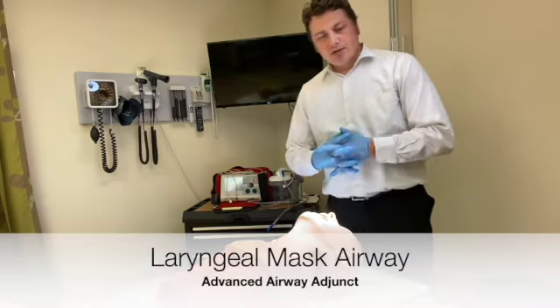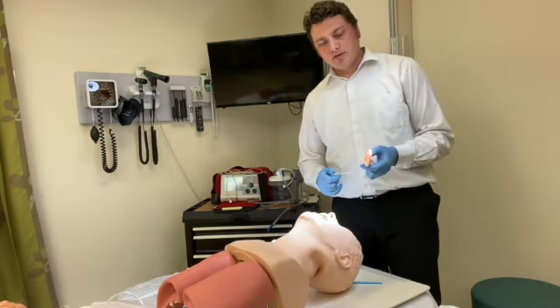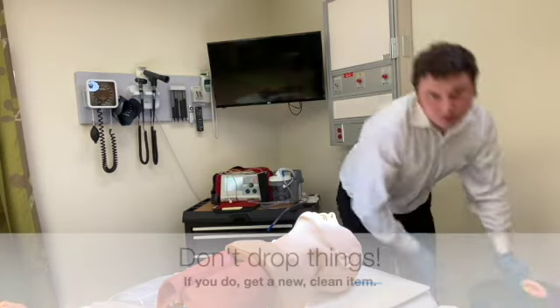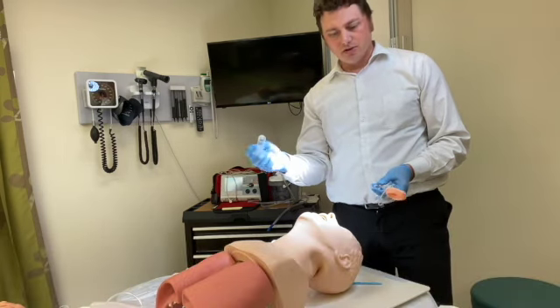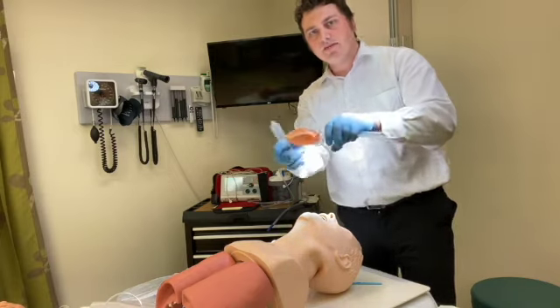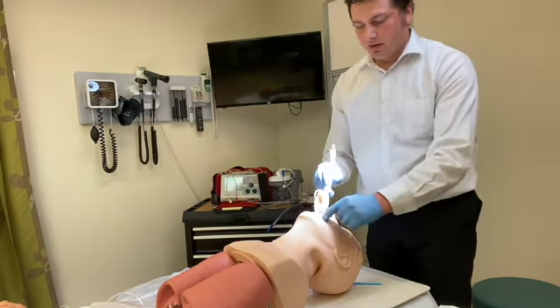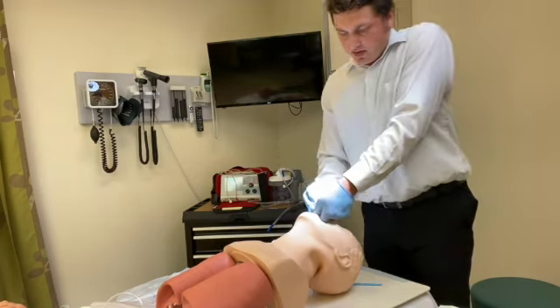Moving on to more advanced airways, LMA, which really is something that you might want to consider after a failed endotracheal intubation attempt, which would be more definitive. You don't want to drop anything, but you want to use the syringe to take all the air out of the device, like so. So it's nice and flat. In a sniffing position, neck flexion, nose up, you'll place the LMA just directly all the way back past the tongue.